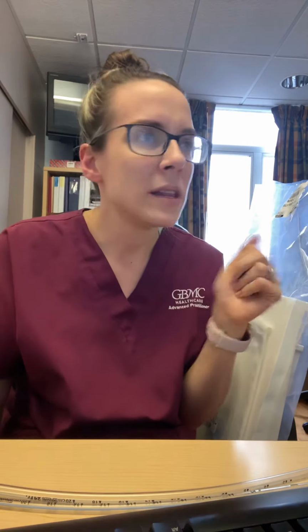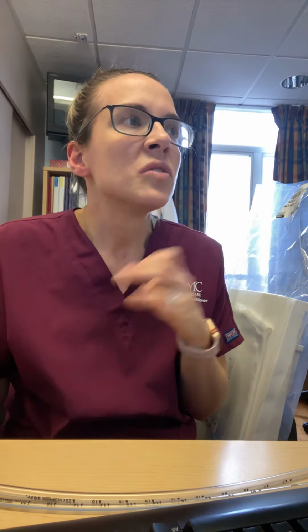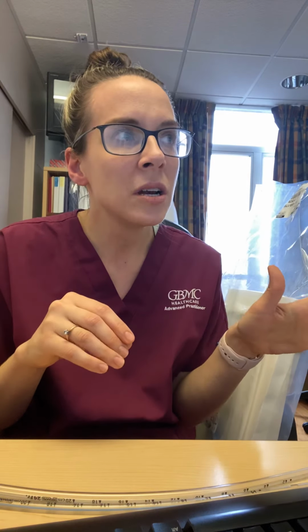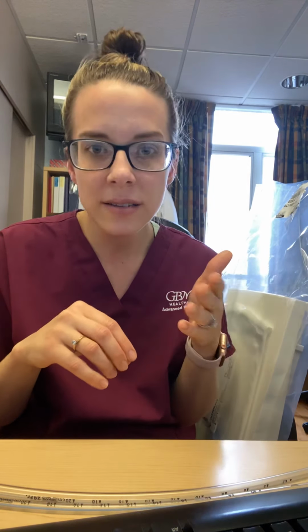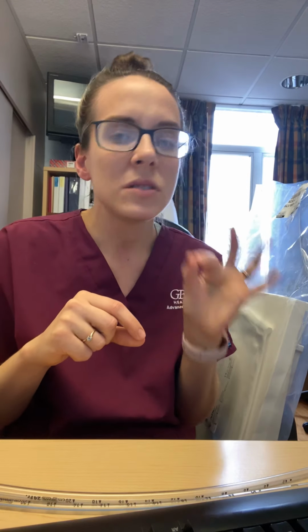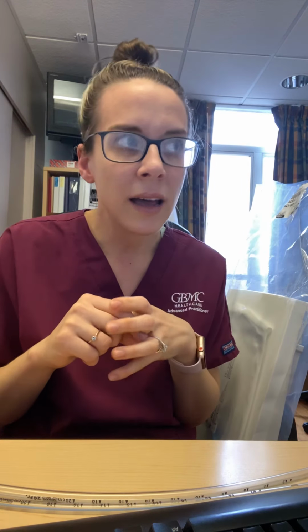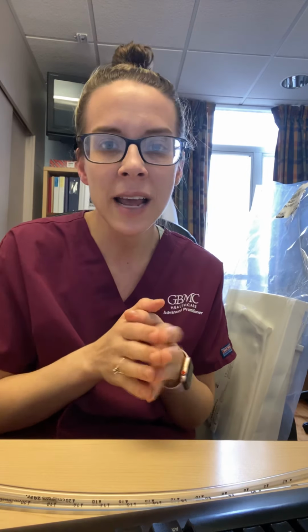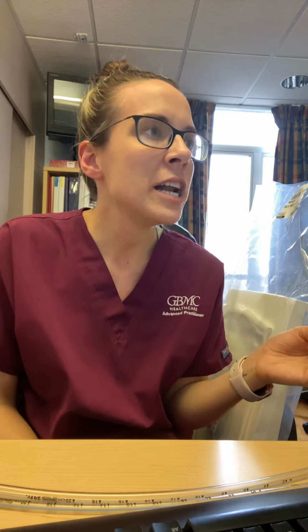There's two different types of chest tubes. I'll show you that a little bit more in the next slide. So let's go to the next slide. So there's two different types of Atrium Pleur-evacs. There's wet suction, which is on the left, and then there's dry suction, which is on the right. So I starred the dry suction because I don't think I've ever seen a wet suction drainage container. It's like an older method of chest tube drainage.